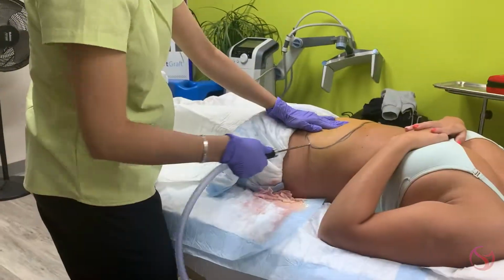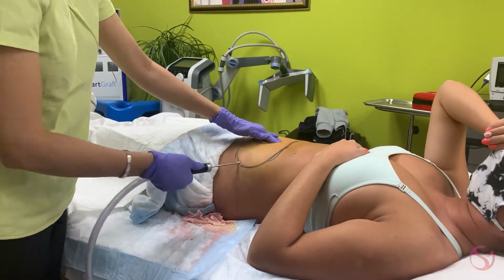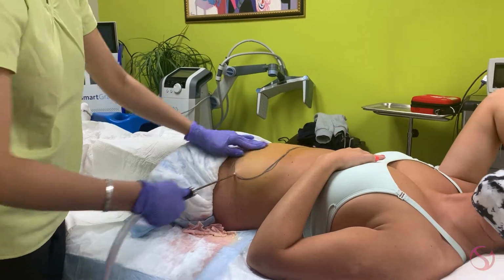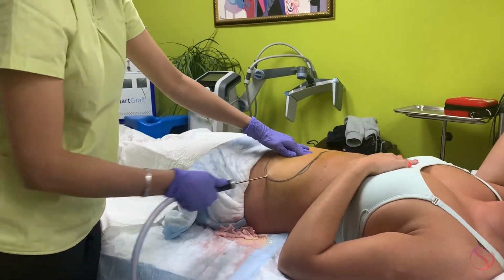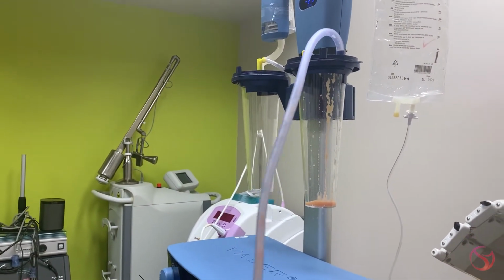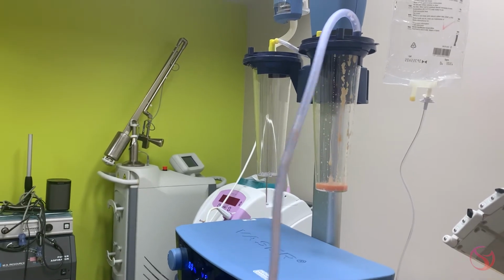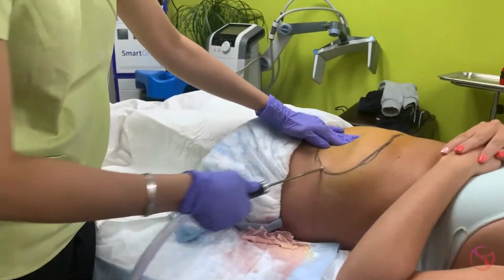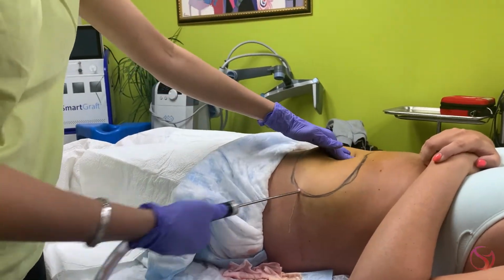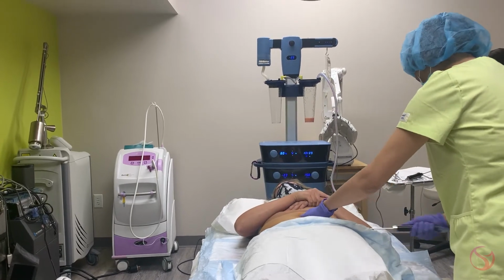And now I'm on to the step after the fat has been liquefied of actually removing it with a cannula. And again, these cannulas look a bit scary, but you can't feel them at all once the skin is numb. And you can see all that nice fat coming out. Again, fairly avascular. There's really not much bleeding at all. And it's just that nice fatty tissue that has been liquefied coming out. So not much trauma at all with this type of a process compared to traditional lipo.